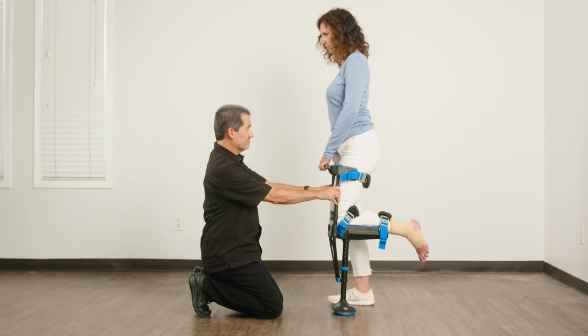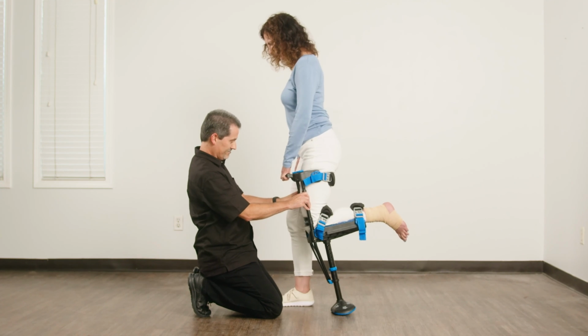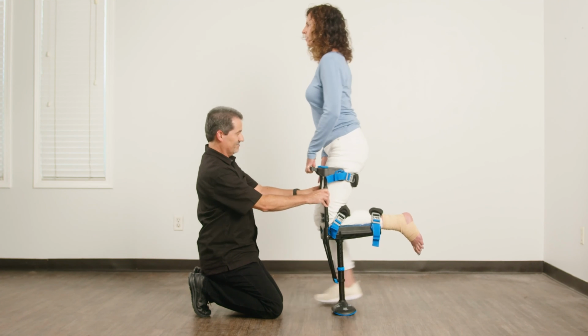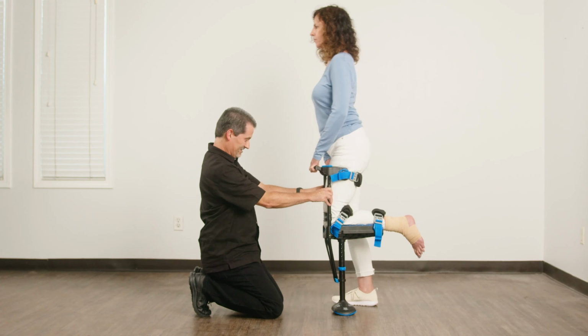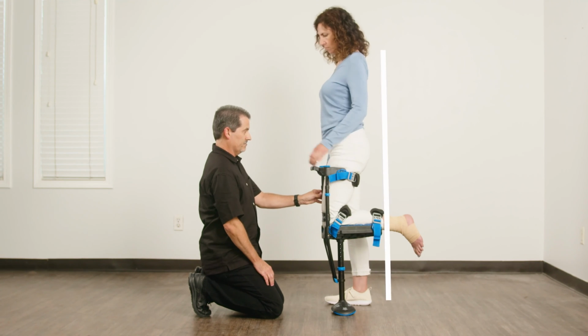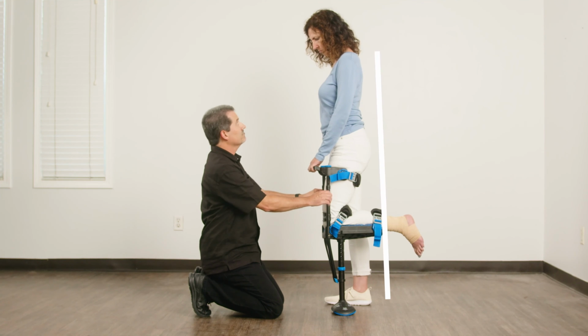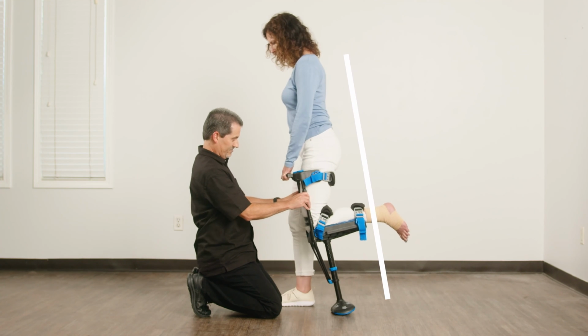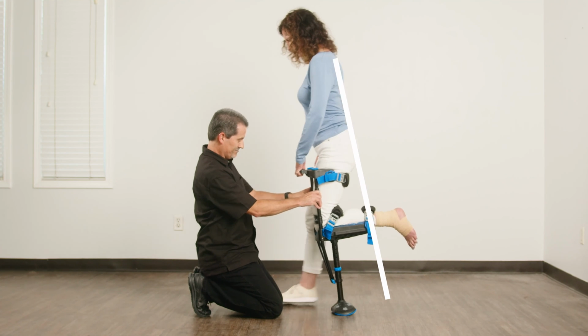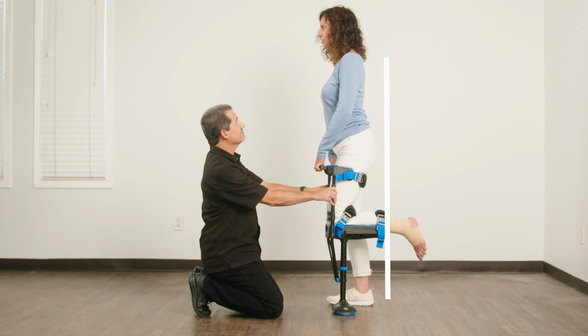Instruct the patient to put most of their weight on the iWALK leg, and to lean forward, and when it feels natural, take a step forward with their good leg. You can pull forward slightly on the crutch if the patient doesn't lean forward on their own. In order to initiate walking, the upper body has to advance so that it is in front of the iWALK foot. That means the patient must start leaning forward before they take a step. The step with their good foot will happen naturally.